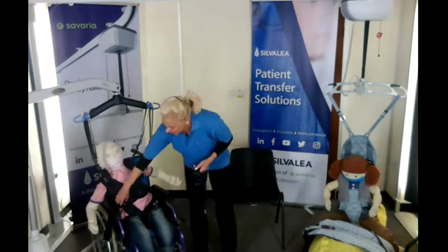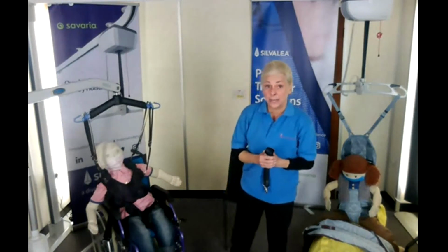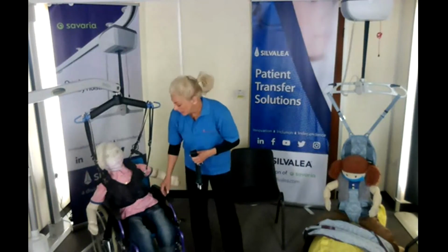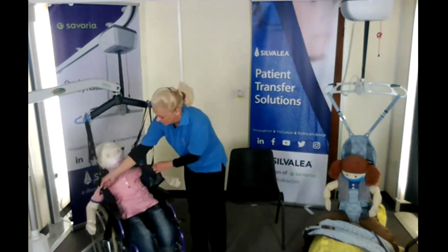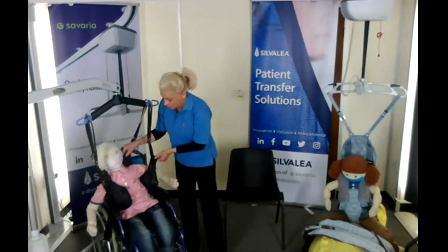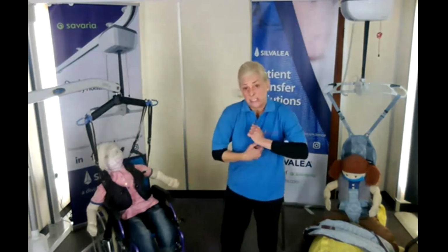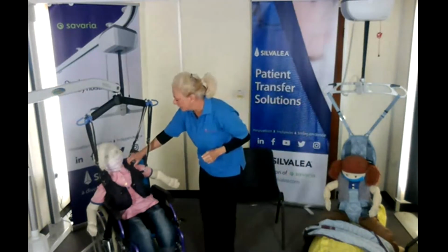Little clips here. So if we need to transfer for toileting, you know, if you've got a weight bearing youngster who can then stand, then they can take the groin section down and take it back for a toileting transfer. Little zip to help put it on. And a new development, if you're used to this, is that there is a shoulder opening. So you actually apply it like a tabard. So that was changed recently so that if you had got someone with contracted arms, it was difficult to get a waistcoat type thing on. So they have developed this to have a click at the shoulder.